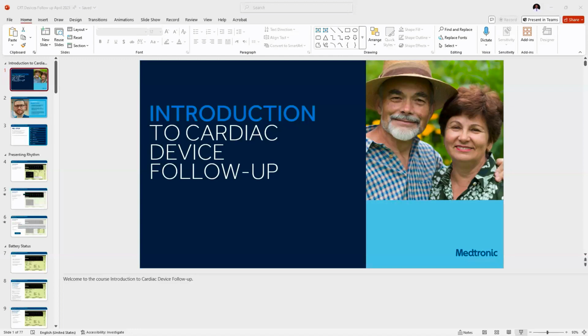And this is in the same window as where you get to change the V pacing and the VV delay. The sensed AV and the paced AV, you're able to adjust in the same window.